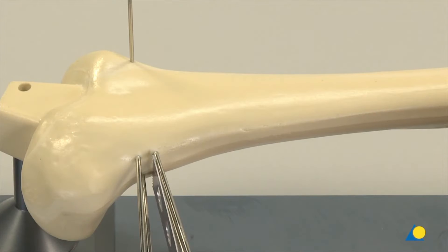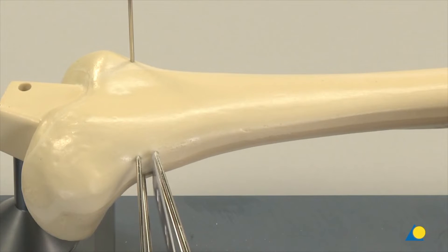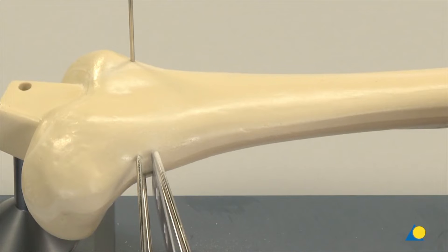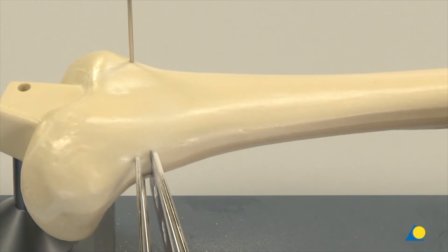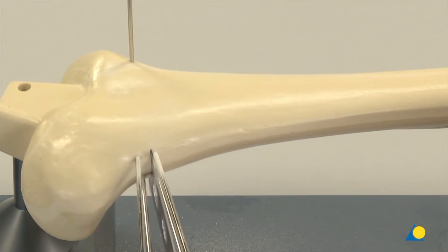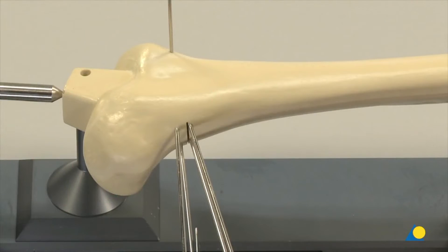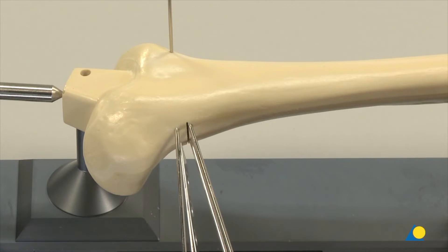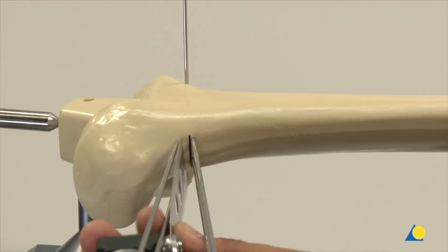It is important to ensure that a fresh saw blade is used. A blunt saw blade can lead to thermal necrosis of the bone and the surrounding soft tissue. When sawing clinically, the soft tissues dorsally must be protected with a Hohmann retractor, and the saw blade is kept cool.